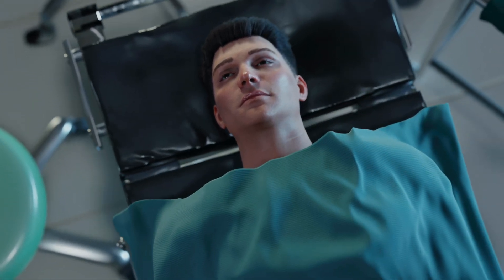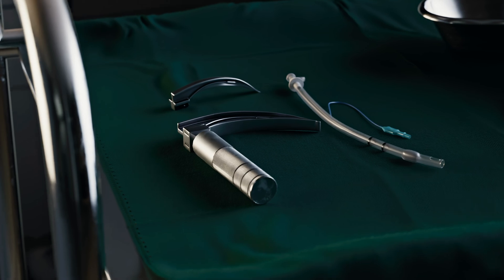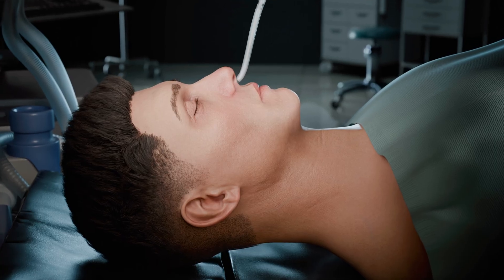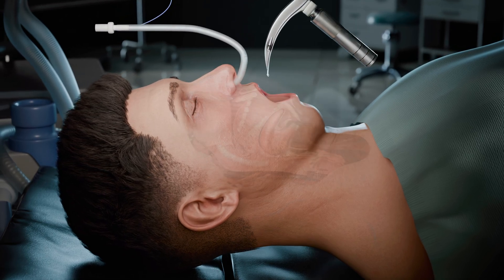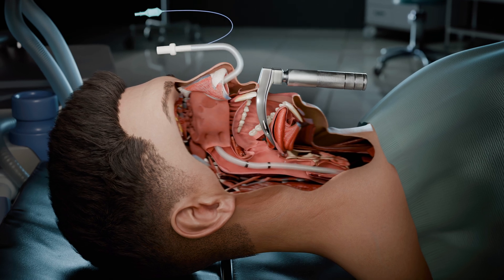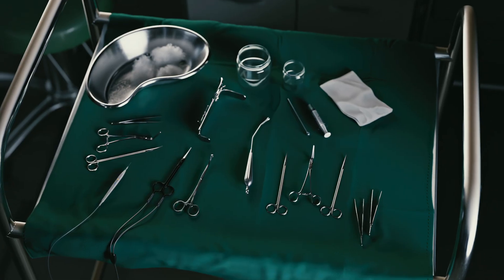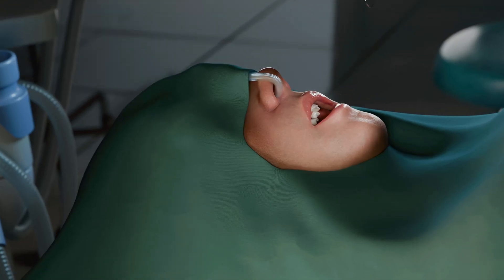The procedure is performed under general anesthesia. Following premedication and induction, image-guided nasotracheal intubation is carried out. The endotracheal tube is inserted through the nasal passage into the trachea. This method provides unobstructed access to the oropharynx and optimal visualization. The tube is then secured and connected to a mechanical ventilation system.